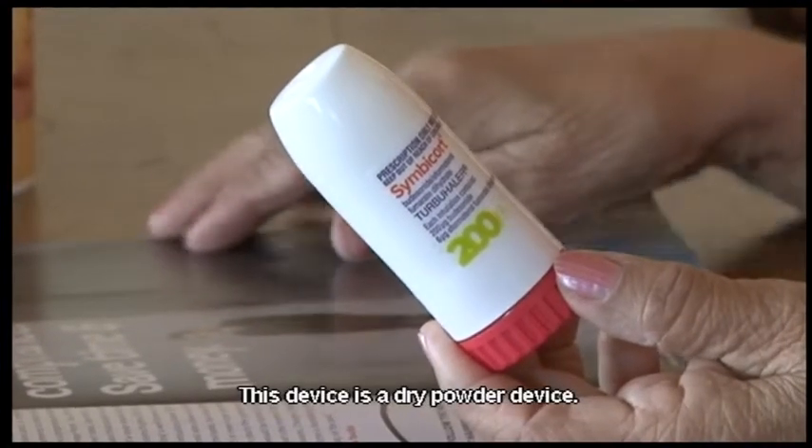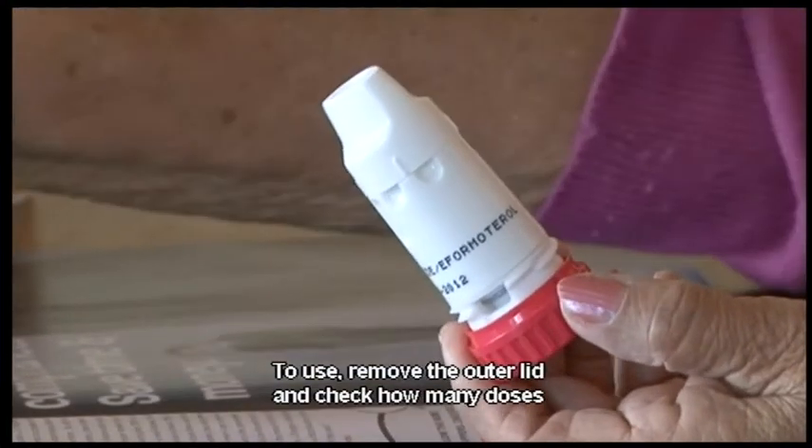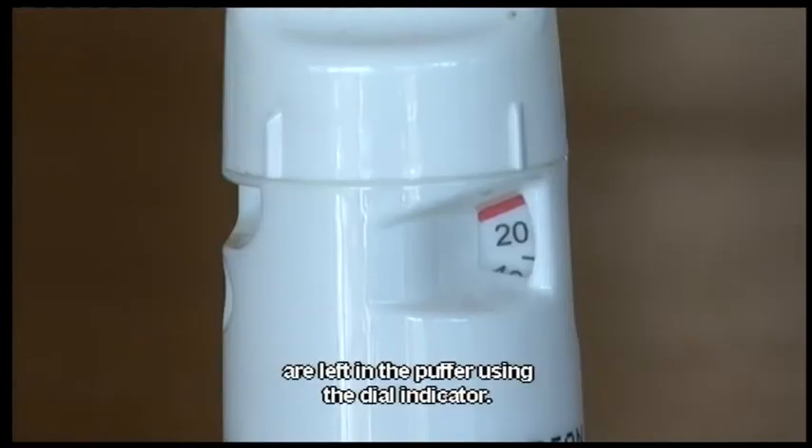This device is a dry powder device. To use, remove the outer lid and check how many doses are left in the puffer using the dial indicator.